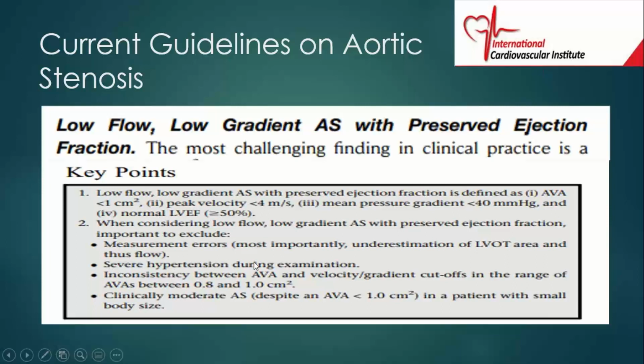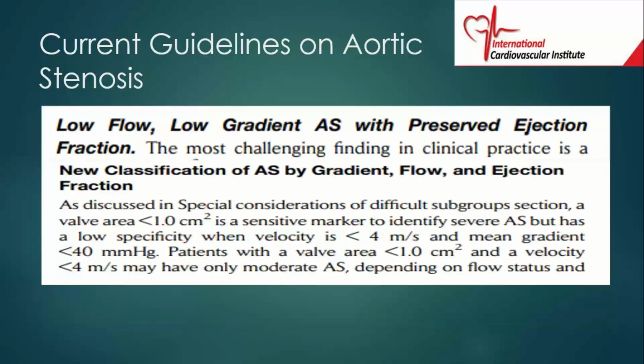Did the patient have severe hypertension during the exam? And then you need to look: is it a small patient with a significant hypertrophic ventricle with a small LV cavity? So this is how they want you to approach these patients.